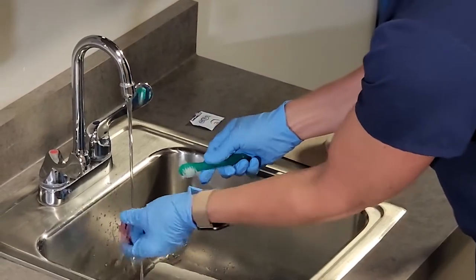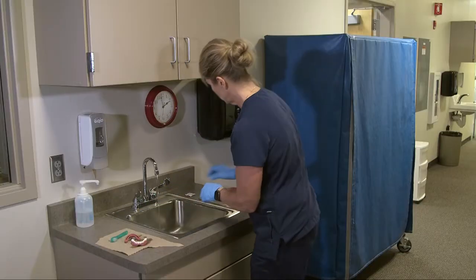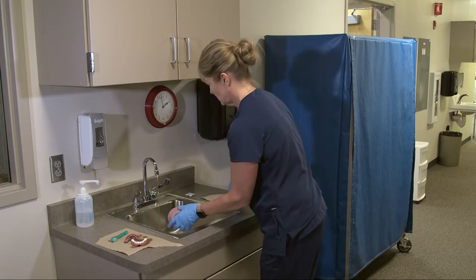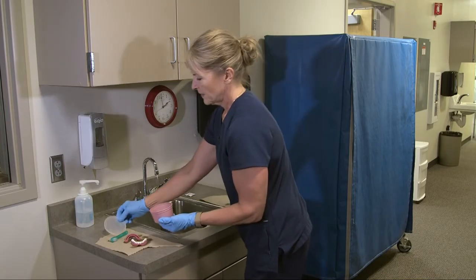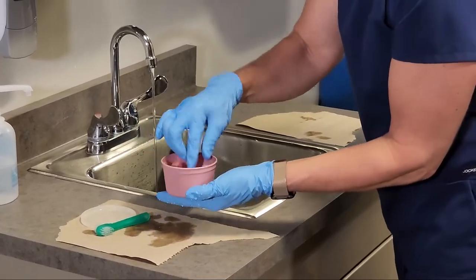I want to make sure I rinse that thoroughly and rinse the denture brush, and then I want to make sure I rinse out the cup and the lid. And then if I were going to give the dentures back to the resident, I'm going to put them in the cup.